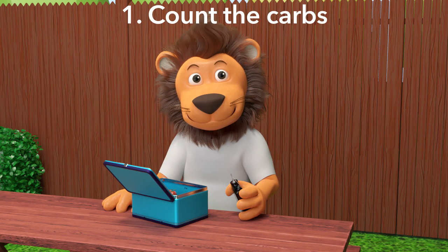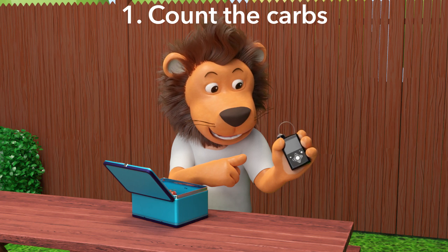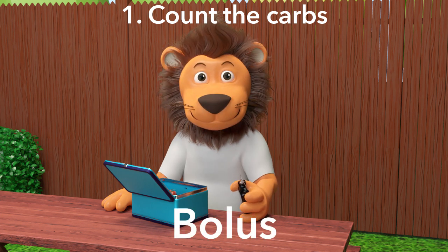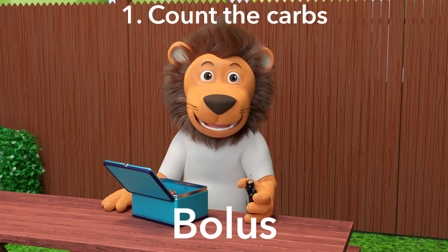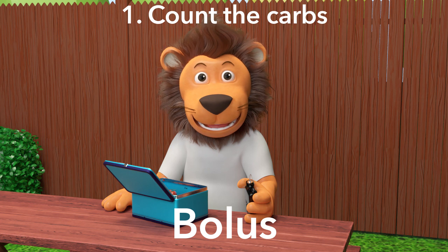But why is it important to count the carbs of the food you eat? We need to tell the pump how many carbs you are going to eat so that it knows how much insulin to give you for your meal. We call this a bolus. Remember that you need to bolus whenever you eat carbs, which means giving yourself insulin for the carbs you are going to eat. Insulin helps your body use the carbs from your meal to give you energy.